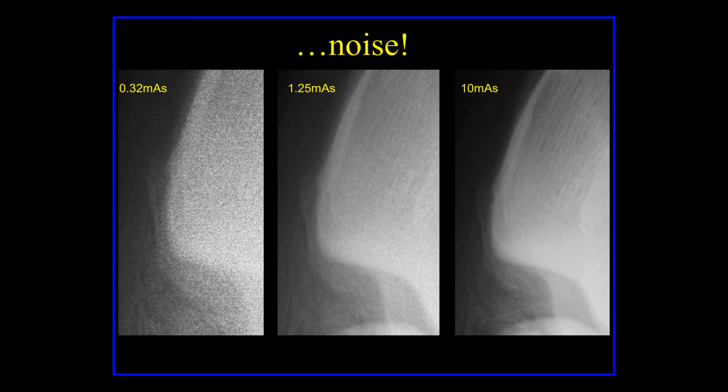If you turn those two knobs up, the kVp and the mAs, with digital systems, it doesn't make the film blacker, it makes it better quality. So it makes it less grainy when you turn up the technique. And so there's some fine line in there. There's a balancing act: for radiation safety purposes, we want to use the lowest technique we can, but for image quality purposes, we want to use enough technique to have good image quality. Okay.